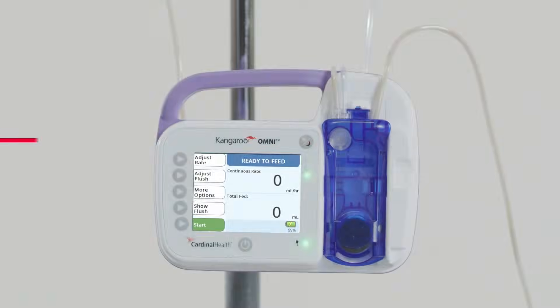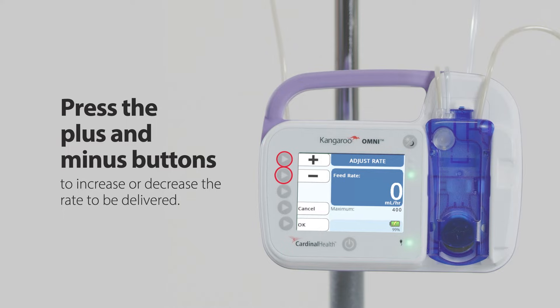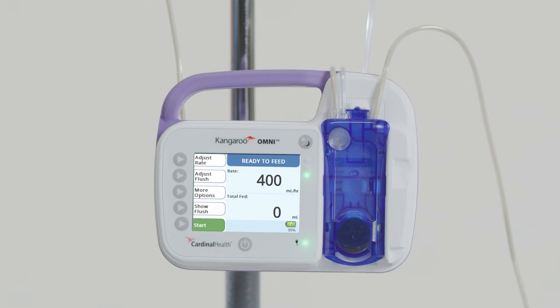When the pump is primed, the Ready to Feed screen will appear. For continuous feeding, press the Adjust Rate button. Press the plus and minus buttons to increase or decrease the rate to be delivered. Push and hold either button to accelerate the numbers. Press OK when the desired rate has been selected to return to the Ready to Feed screen.